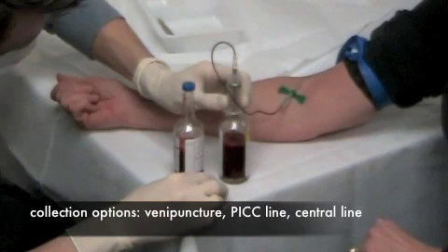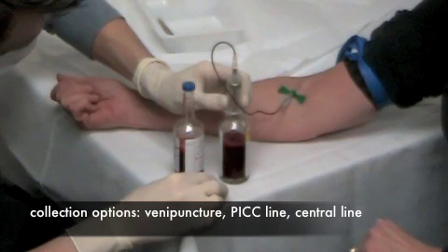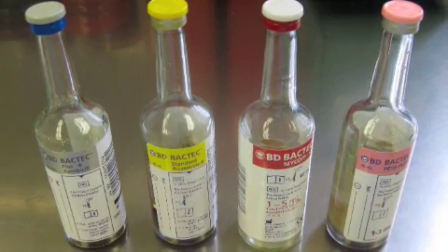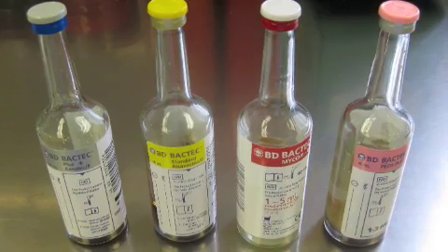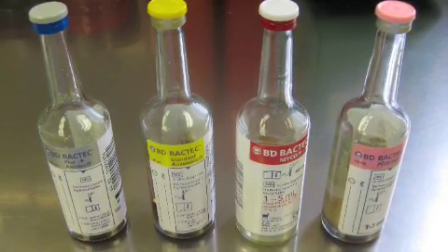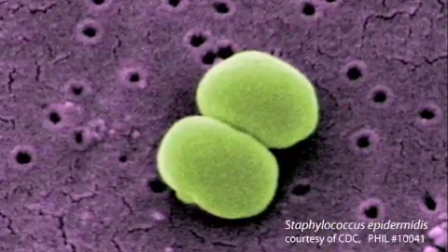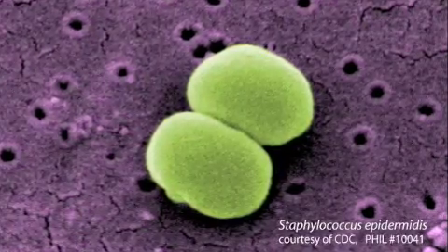Blood culture is usually performed by venipuncture, but can also be collected from indwelling lines. Aerobic and anaerobic vials are typically drawn together as a set and constitute a single culture. Smaller blood culture vials are used for children since less blood can be collected. Contamination is very common, occurring in up to 4% of all cultures and making diagnosis a challenge.